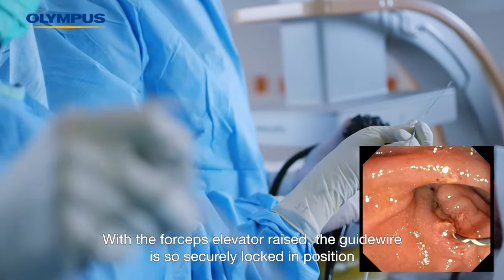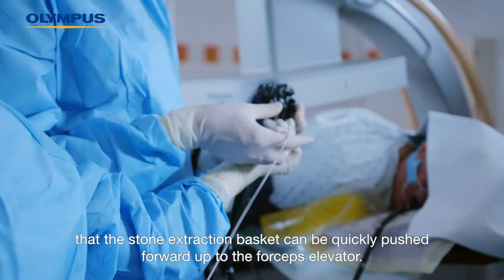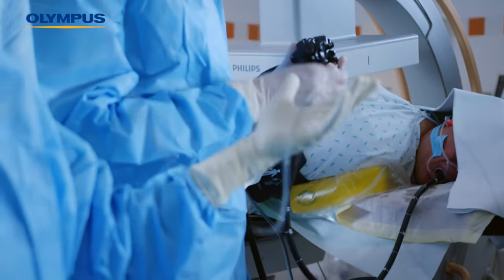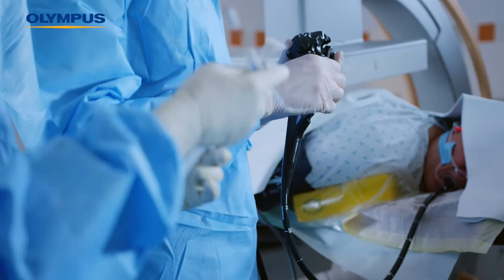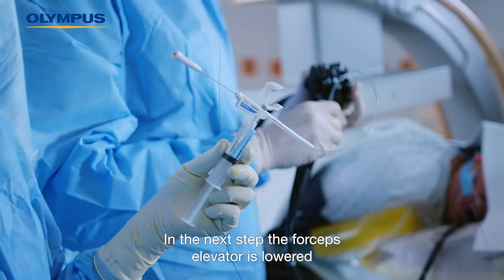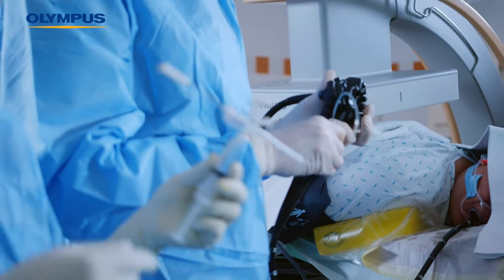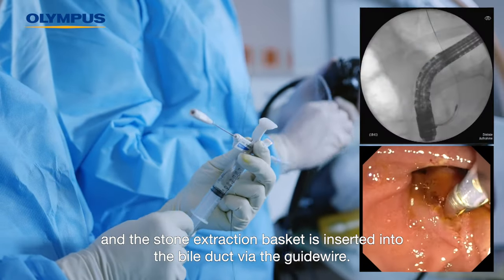With the forceps elevator raised, the guide wire is securely locked in position so that the stone extraction basket can be quickly pushed forward up to the forceps elevator. In the next step, the forceps elevator is lowered and the stone extraction basket is inserted into the bile duct via the guide wire.